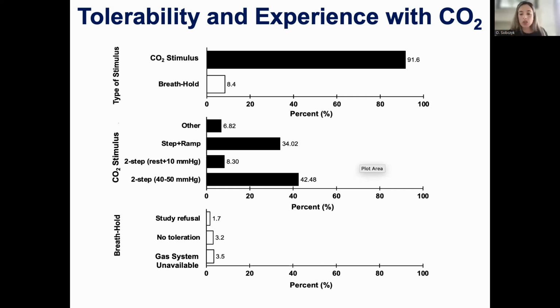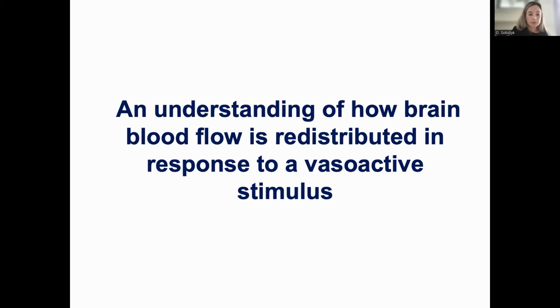But the most important issue is that over 20 plus years of doing CVR and over 1,400 CVR cases in total, we have not had a single adverse event to CO2. Over the years, we've come across very interesting principles regarding the stimulus and its effects on CVR. Regardless of whichever method you choose to deliver CO2 to measure CVR, one of the most important requirements in using CO2 is to ensure an understanding of how brain blood flow is redistributed in response to a vasoactive stimulus.